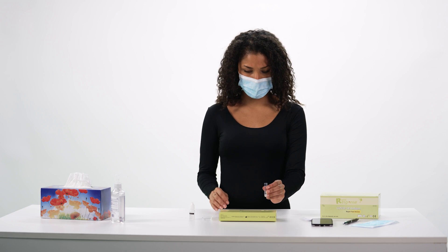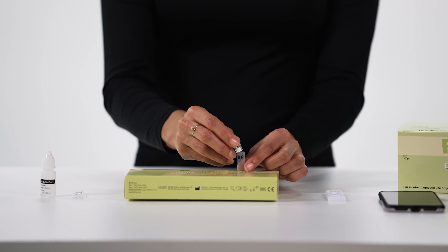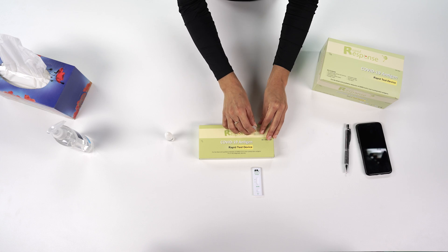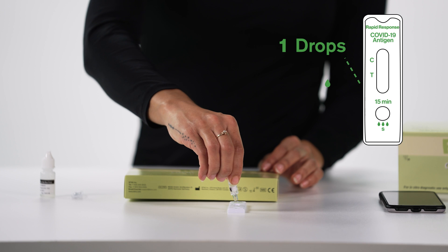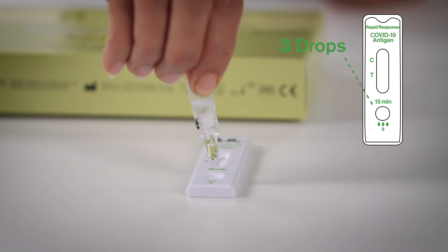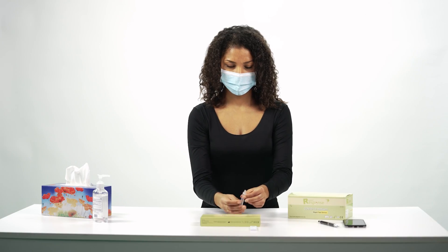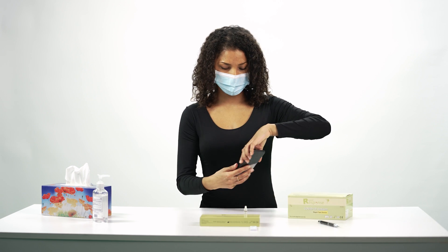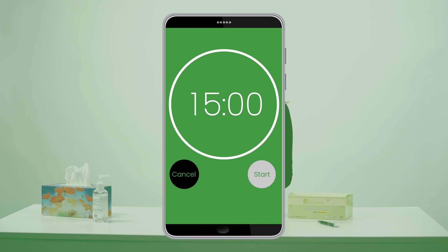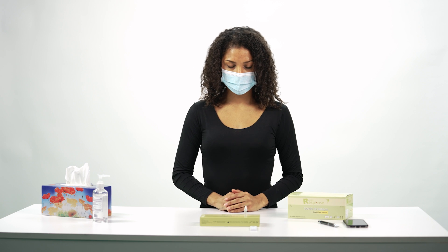Remove the swab and throw it in the garbage. Then attach the nozzle to the extraction tube. Invert the tube and add three drops of the sample to the sample well at the bottom of the test device by gently squeezing the tube. Do not add the sample to the results window, which is the longer window above the sample well. Set a timer and wait 15 minutes before reading the results. While you wait for your results, wash your hands thoroughly or use hand sanitizer.